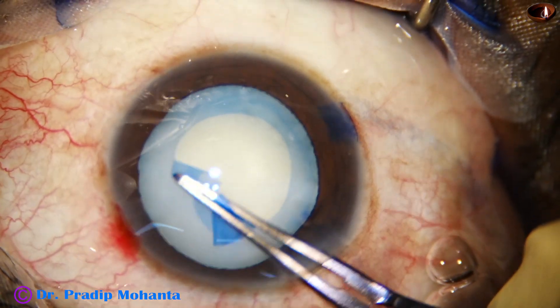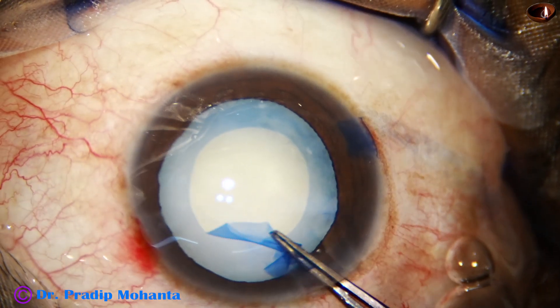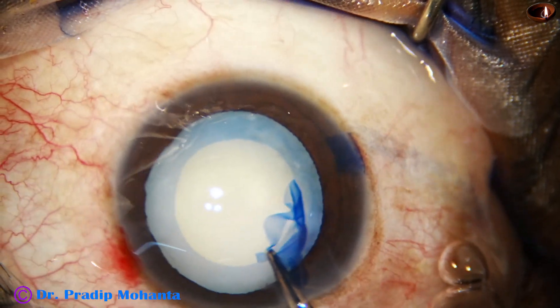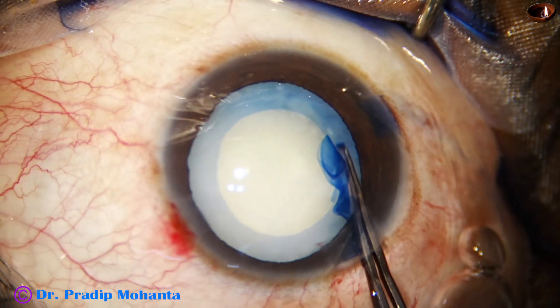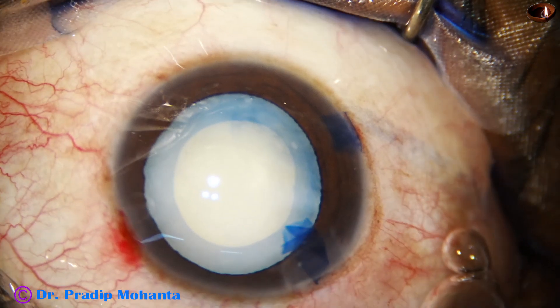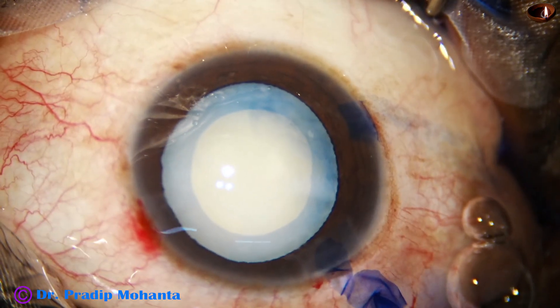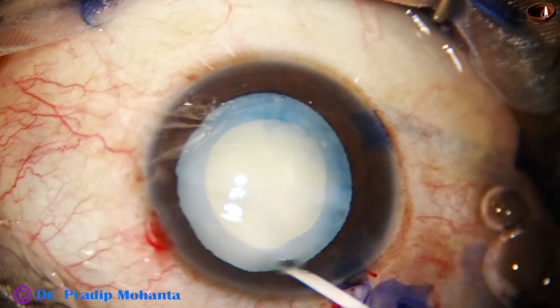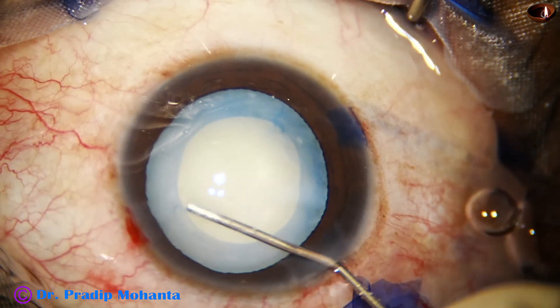I complete the rhexis — a little bit of spiraling of the capsule is done to get a round rhexis. This is an optimum-sized rhexis; the size is about 5.25 millimeters.